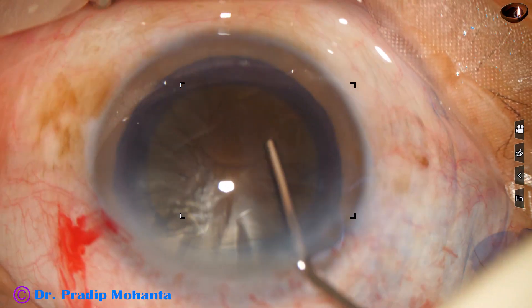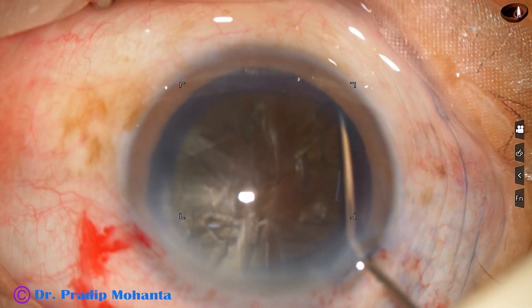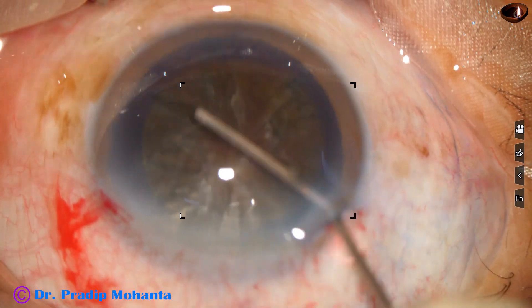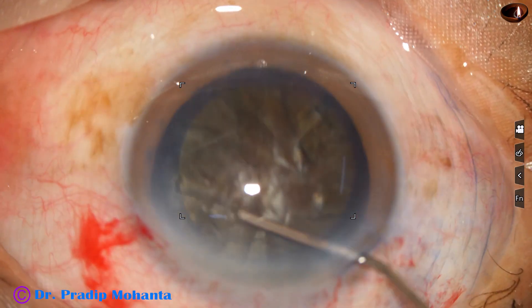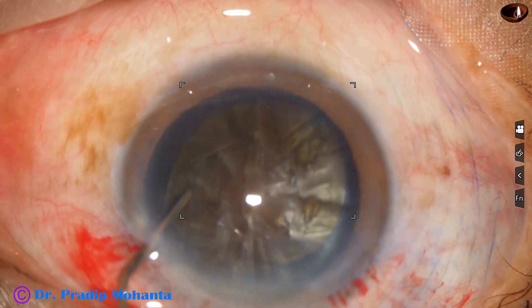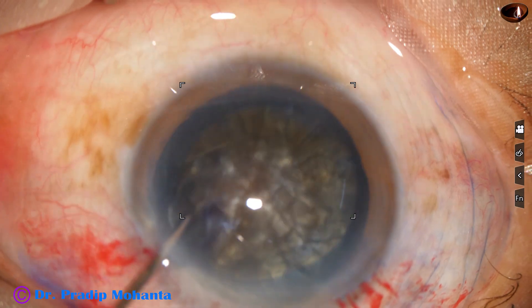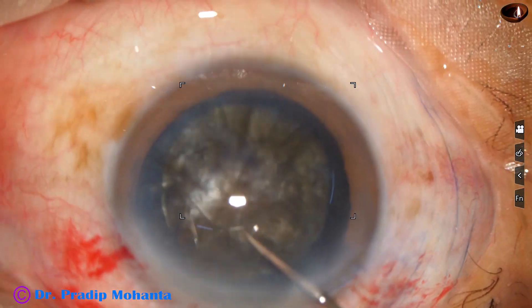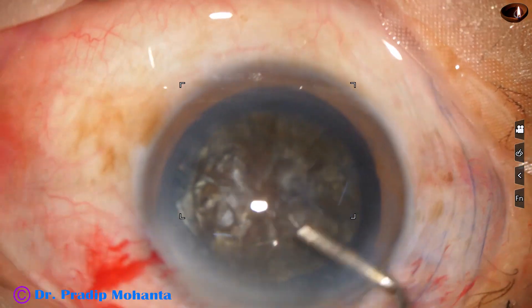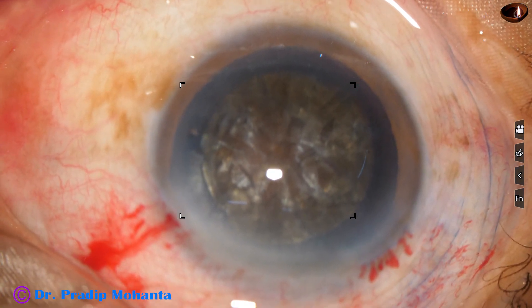In hard cataracts, when the cataract is so hard, we should do a large rhexis like this — nucleus management becomes easy and possible. Now hydrodissection is done at multiple points, injecting small amounts of BSS. The nucleus is stabbed and then mobilized, and we can see that the nucleus is rotating nicely in this case.